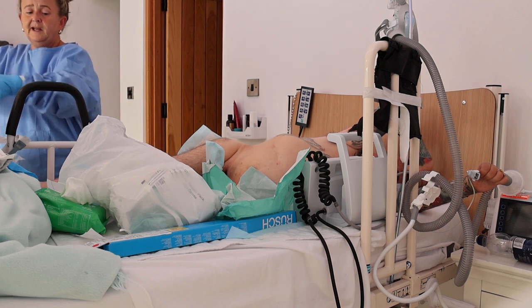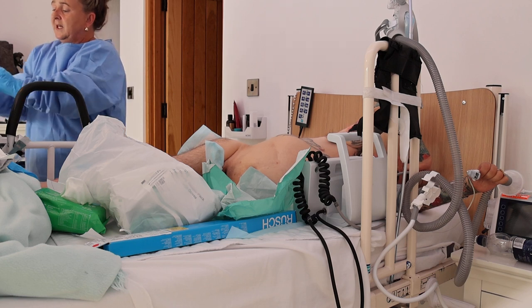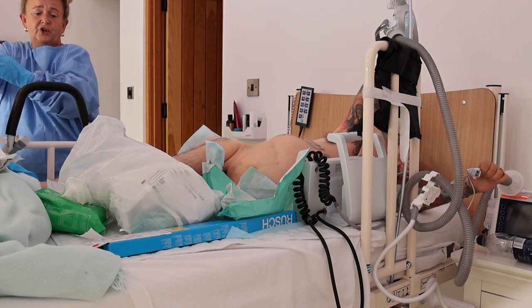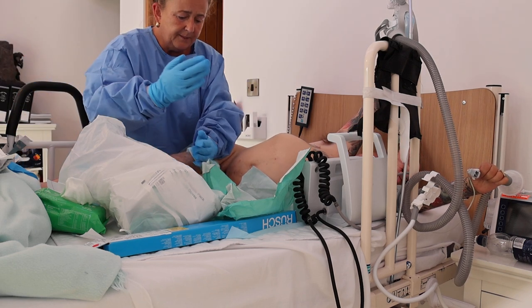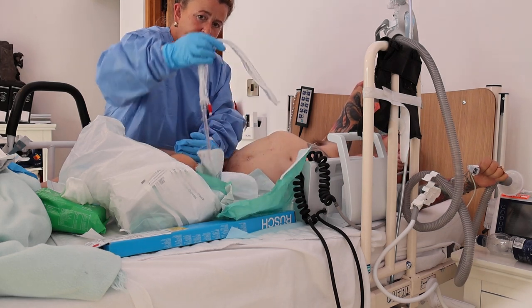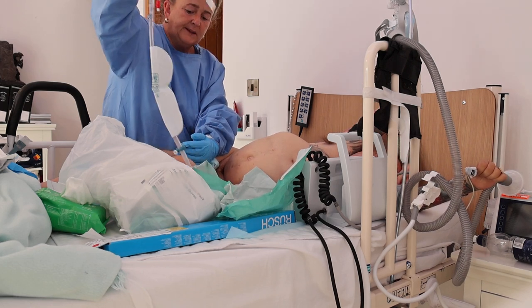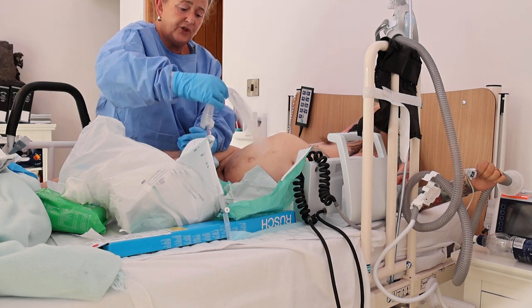And people will be saying, why are you leaving your stoma open? Sometimes I don't. Sometimes I leave the syringe in. But you know what? I've got time to put this new one together. So my hands are both sterile. I'm going to move back down. And I've got the catheter right here. And I've already put the Instillagel in, so I've got it attached to a day bag too. So I can draw back and see if it's in place once I've got it in.